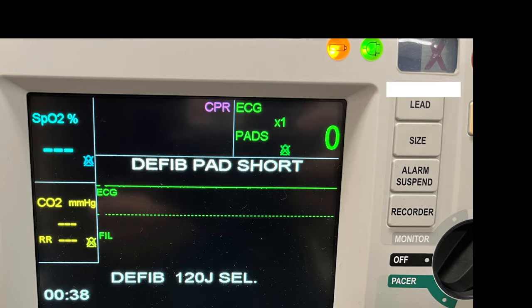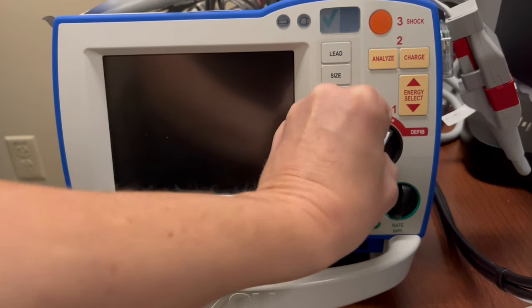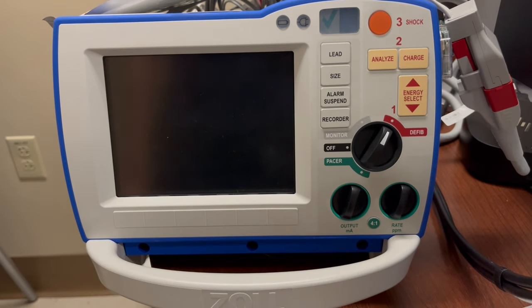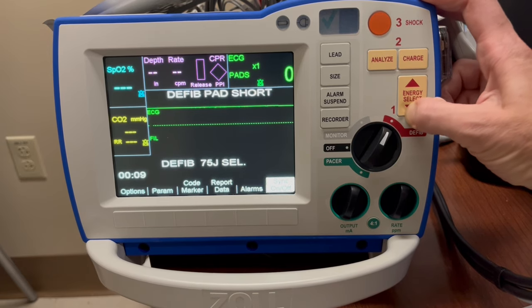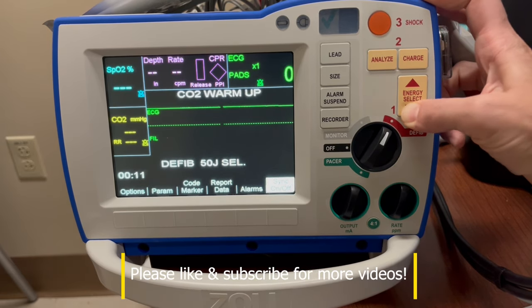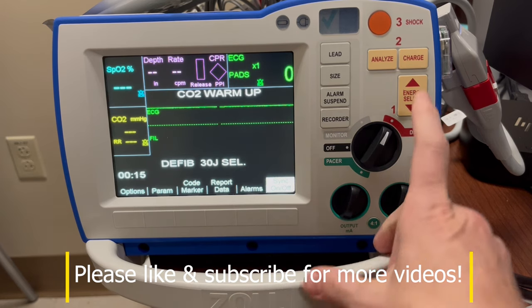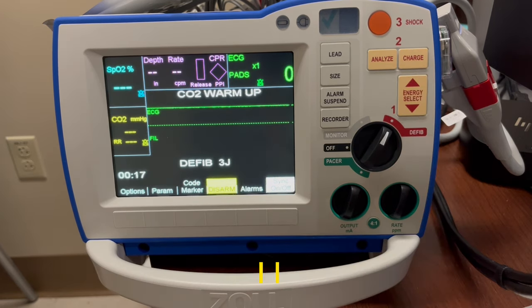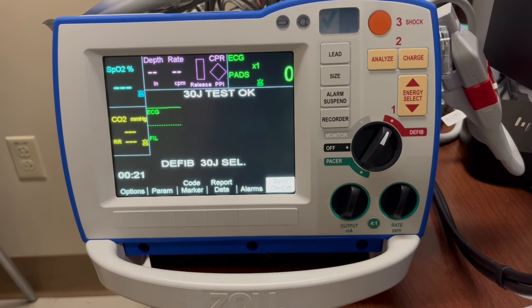Most of the time when you do a self-check, the red X will go away. To do the self-check, make sure your pads are attached, turn the monitor into defib, then decrease the joules to 30, then press charge and shock. The machine will tell you whether the test has passed.